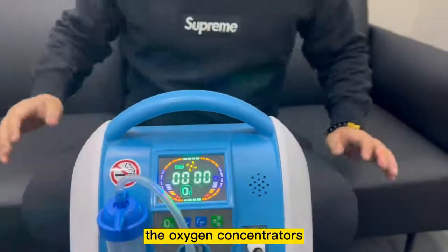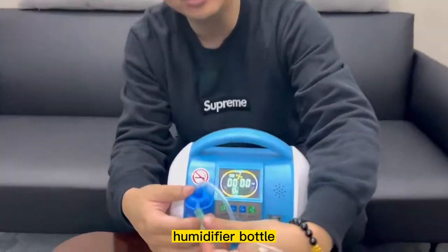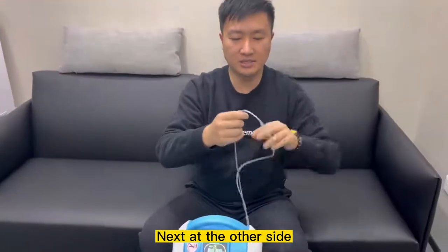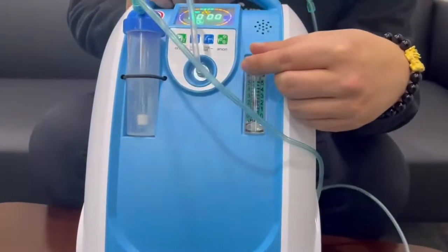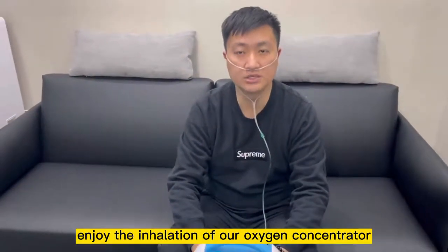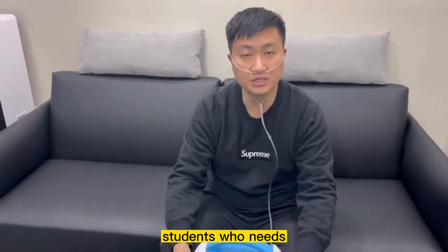Next, I'll just do a demonstration of how to use the oxygen concentrators. To start using, just connect the nasal cannulas to the output of our humidifier bottle. Next, at the other side, aim the nasal to your nose. Wrap the straps behind your ears and adjust it at the bottom of the chin. Adjust the flow rates according to your preference, then you can just relax and enjoy the inhalation of our oxygen. Inhalation of oxygen is actually beneficial to people like pregnant ladies, elderly, and students who need oxygen intake.